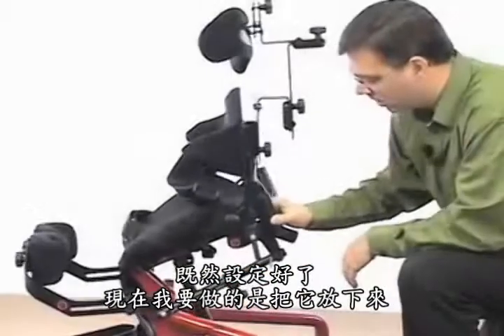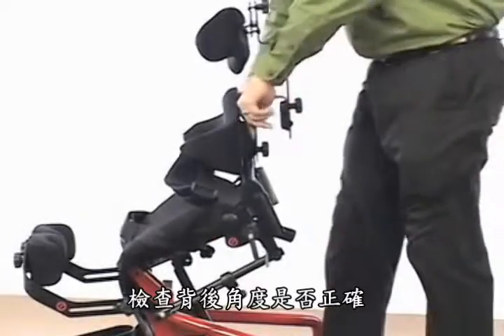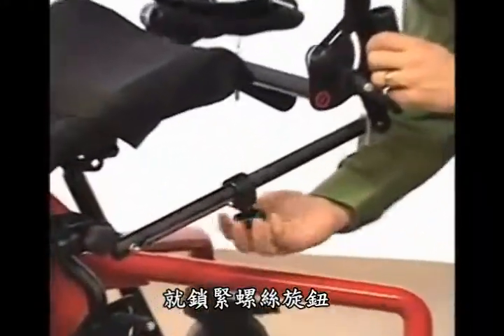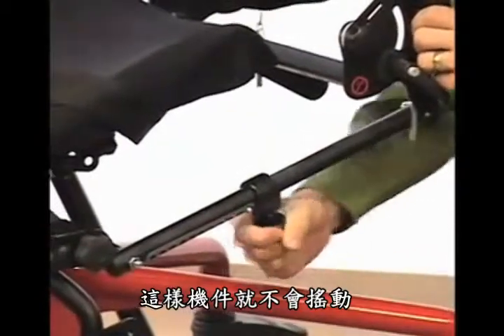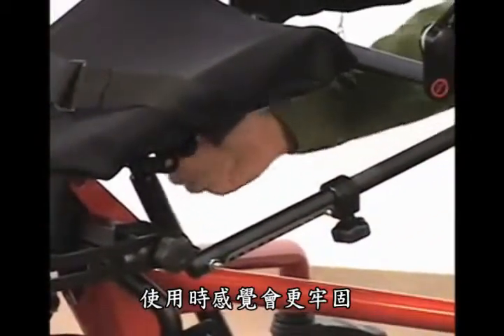Now that it's set, I bring it all the way down and check to make sure the back angle is correct. When it's correct, tighten up your clamps — that'll take any wiggle out of the unit and make it much more of a secure experience for the client.